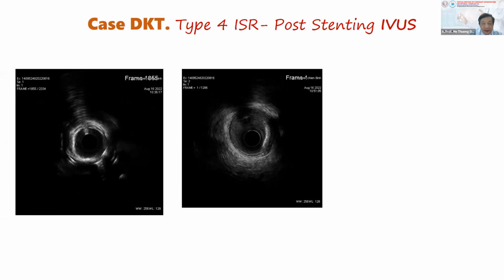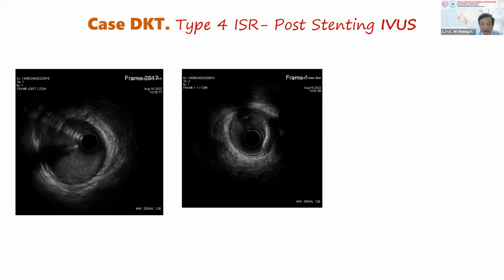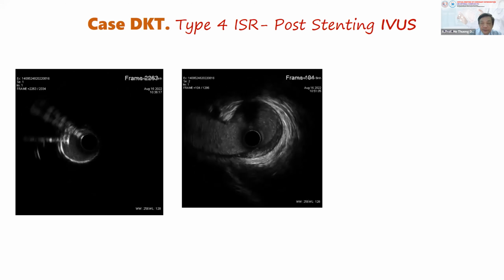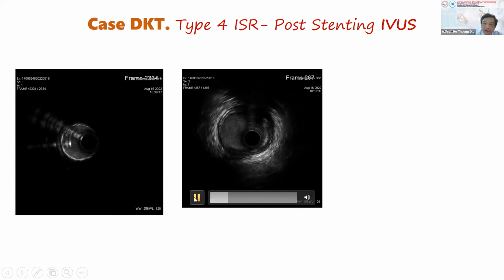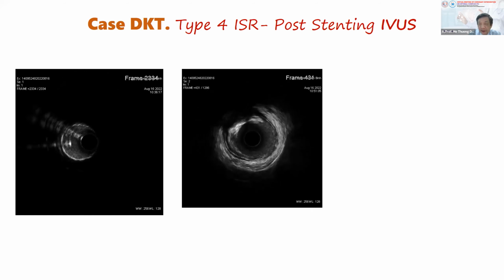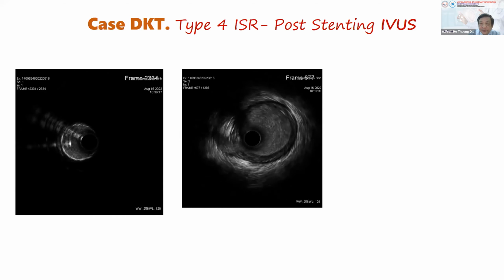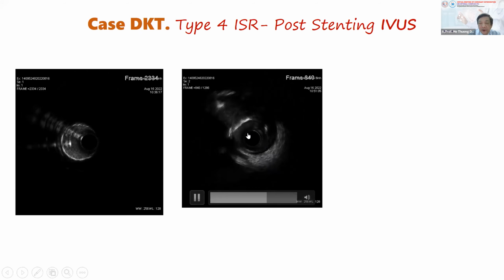Very severe stenosis of the ostium of the LAD. A little bit of the stent protrudes into the left main. This is from the circumflex. The circumflex looks very good, except the ostium and the mid circumflex, which is calcified. Proximal, and now the ostium is very severe.